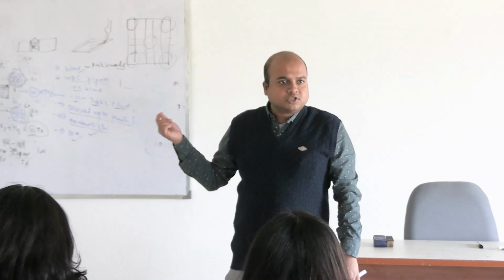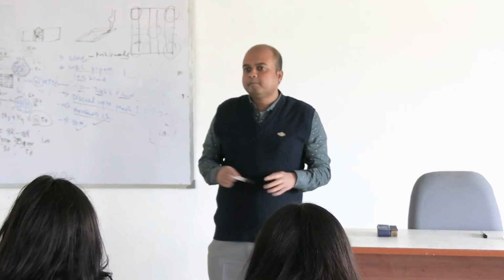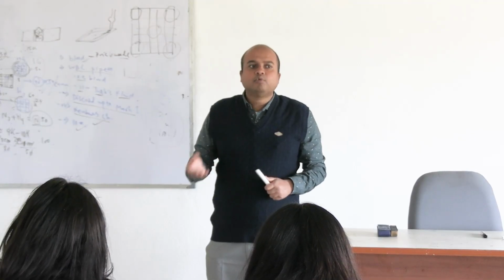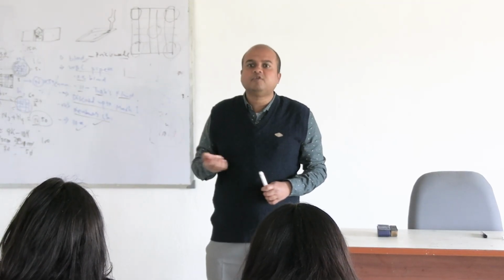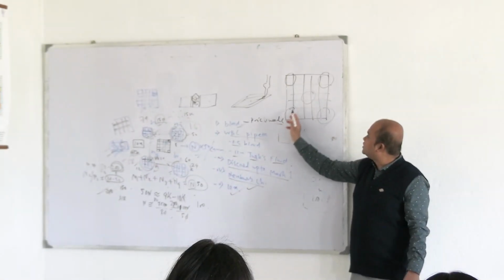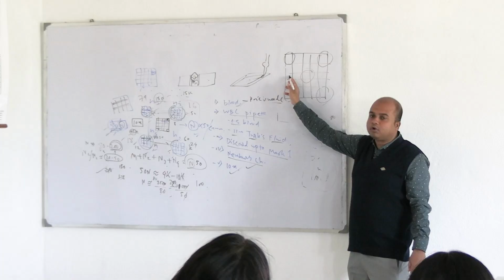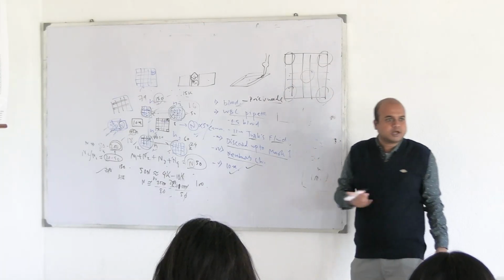Instead of the central square, if you take any of the other squares, that is actually sufficient for your result. Why do we not count all 25? It will take a long time, it is not possible. Why are we taking the central square? Why, after completing the 4, are we not going to the other squares, or why are we actually counting all the corner squares and the central square?